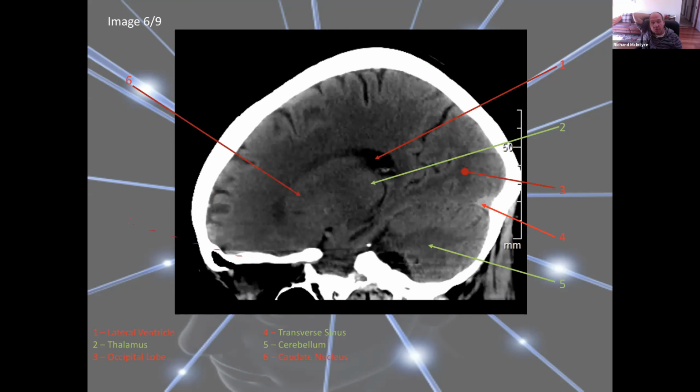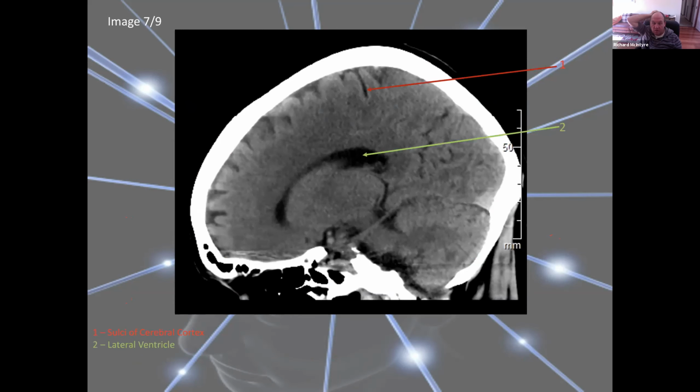But if not, if you Google it, you'll be able to see how you can compare the MRI and the CT of the blood vessels, and again, you'll see that the CT is exquisite detail.